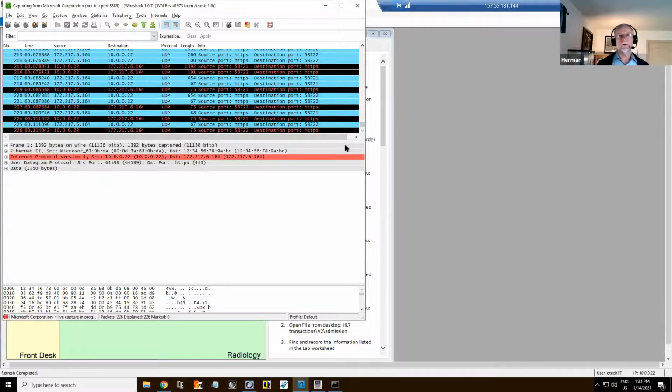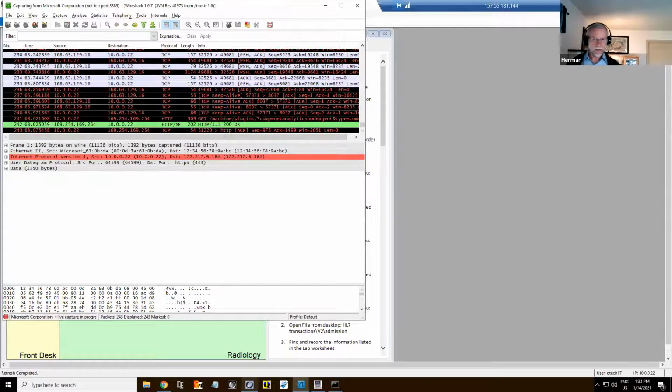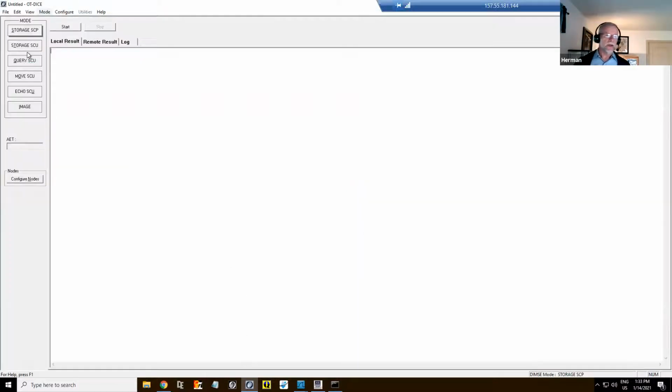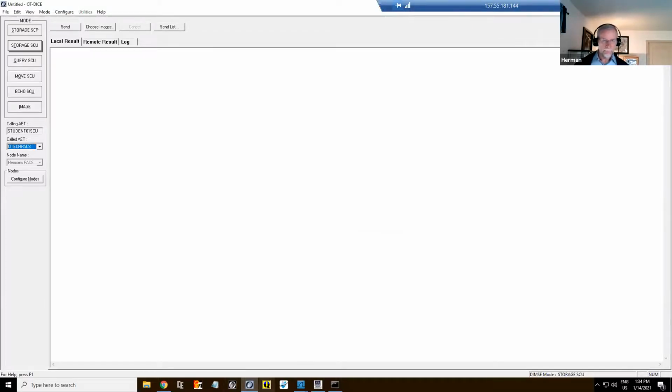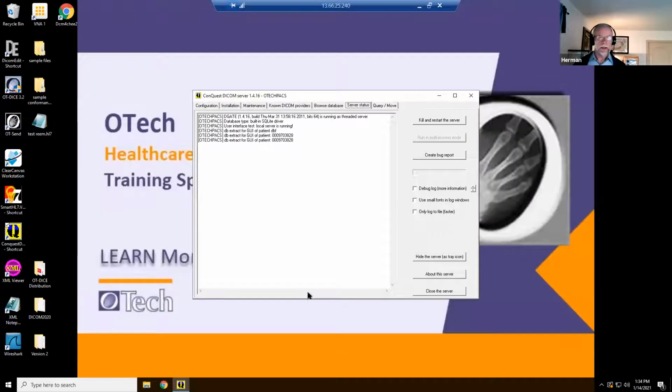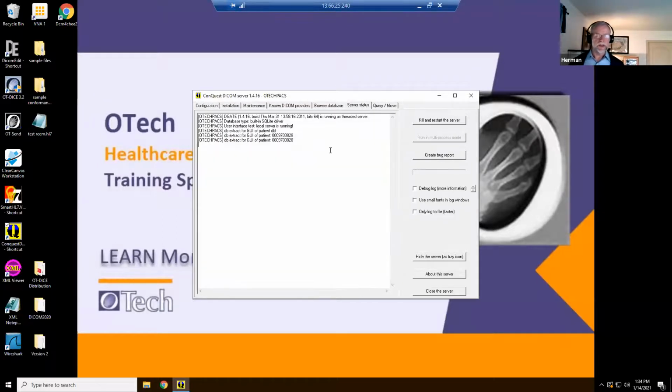Now the next step is we're going to do a DICOM communication. So we go back to OT Dice. This is our simulator. And basically I do store SCP. I select my OTECHPACS, making sure that we have the right PACS as a destination. See, this is Herman's PACS, 10004, 11119 OTECHPACS, right? Why is it 11119 OTECHPACS? Because if I go to my other virtual machine and look at my PACS configuration, see OTECHPACS, AE title, 11119, port number. So cool, it should work.